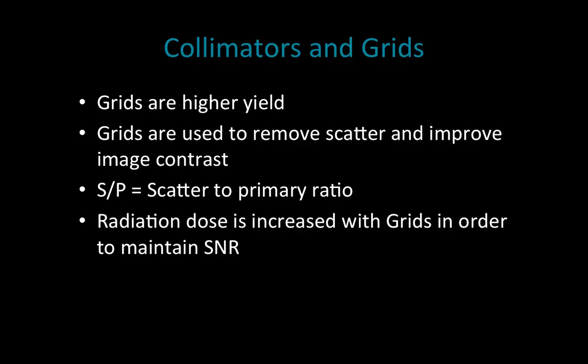In terms of radiation dose, we already mentioned that radiation dose is increased with grids in order to maintain a signal-to-noise ratio — that's the technical term. So grids can improve our image, but that comes with the cost of increased radiation. Something that people tend to confuse is the bucky factor.